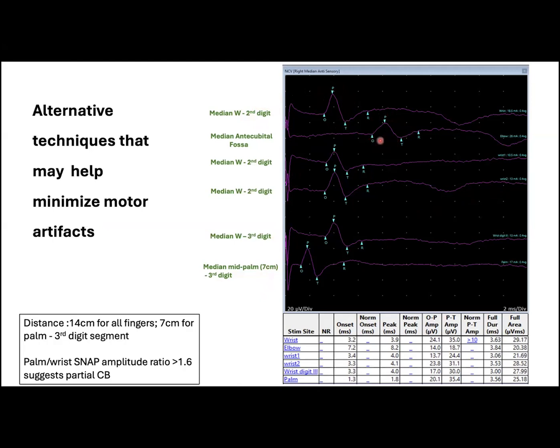The distal snap has normal amplitude and reduced conduction velocity, whereas in the proximal segment, the velocity is normal. But we have to make sure we are not under-stimulating the median nerve at the wrist.